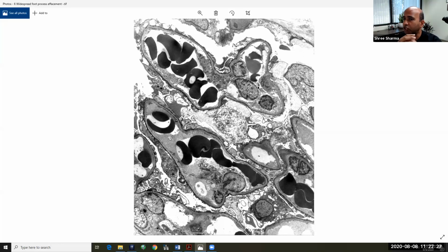You will see a bunch of proliferation around. Only a part of this tuft was damaged. The neighboring part still might be functioning, so the plasma protein will keep on exuding, right? So the matrix will have hyaline material. There will be foam cells which will come to take care of that process. We will go over that morphology later on, but that is exactly what is happening.